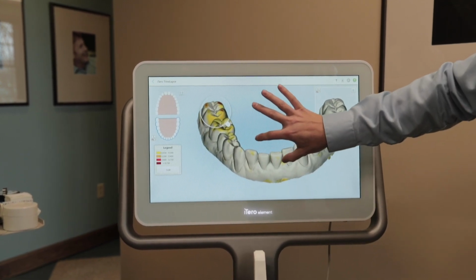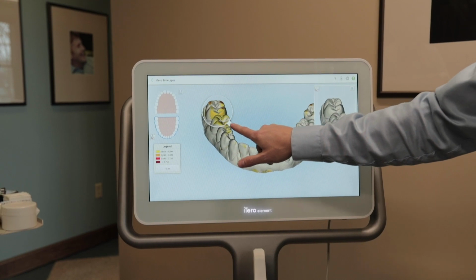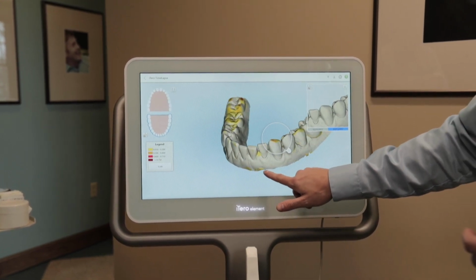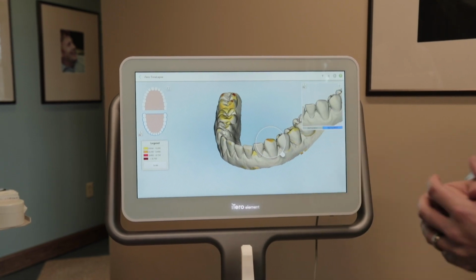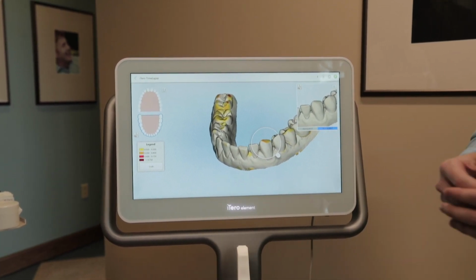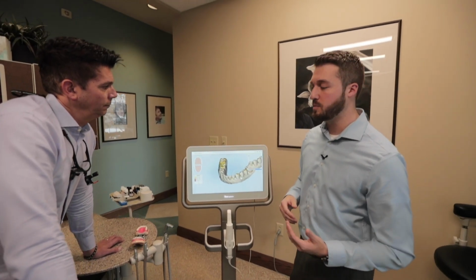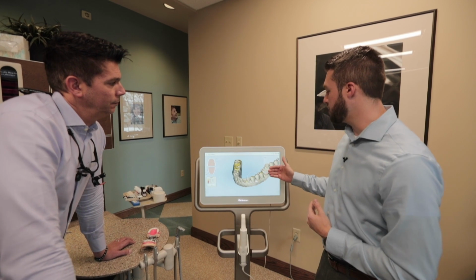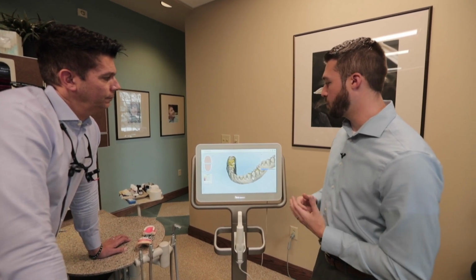Now we can really build our case, or build our knowledge with the patient, of exactly why our treatment plan is necessary, or why monitoring something that's a concern is important, because now we can monitor it and have actual data to back it up. We can show what's going on from visit to visit, whether it's at the 6-month point or the year point, over time. All right, so that's tooth wear.